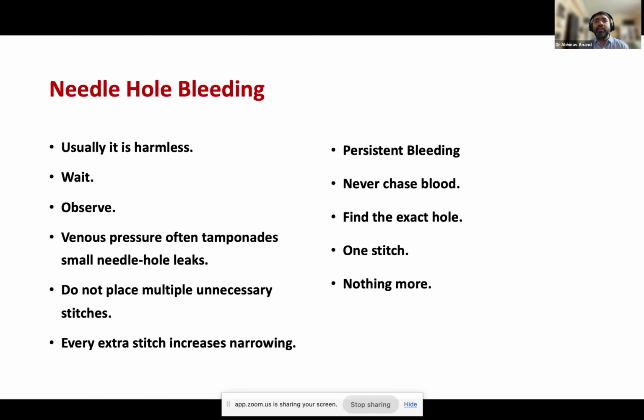First, we start from the posterior wall sutures. We take stays on both sides, but on one side we divide the stay and then we continue suturing with a single suture only. If we take a knot on one side, at one corner suture, then the point of the growth factor decreases because then we have two knots. But still, leaving a good growth factor gives some amount of expansibility to the anastomosis.